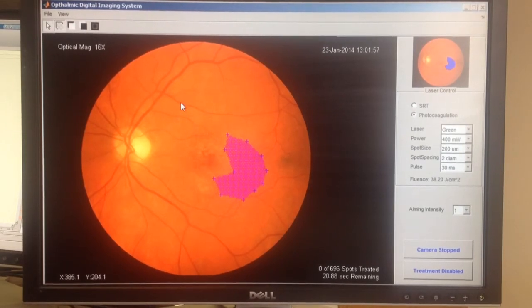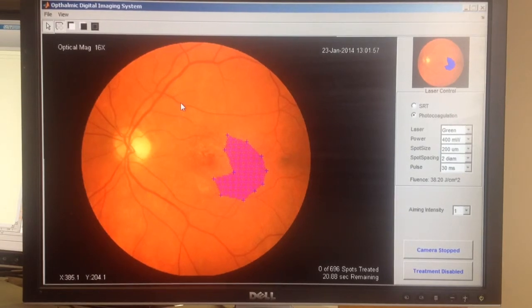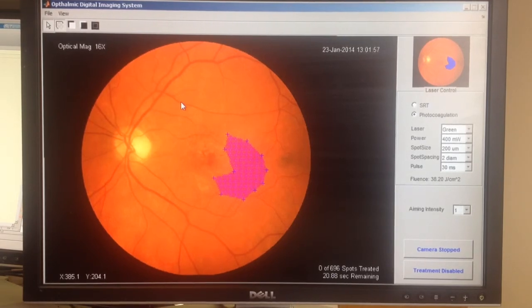Maybe we can do something about moving this forward. I think at this point there's no real focus on getting this done. True. Another thing you should be aware of is this is darn near ready. This is very close. We thought 80 to 90% completed, ready to be integrated with the array scanner, and basically any laser system we want to use with it. Just need company interest to push it forward. That's right.